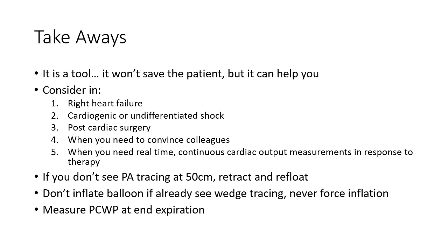All right, so what are the takeaways? We covered a lot of ground. So remember, the PA catheter is a tool. It won't save the patient, but it can help you. Just like an A-line doesn't save anyone, but it's very nice to have to know what you're doing with your therapies. Consider, as we saw, the evidence doesn't bear out using it in everyone.